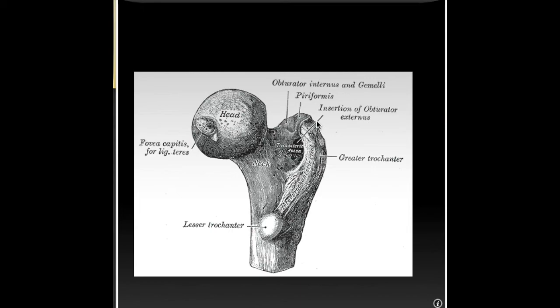So that's going to be one characteristic where we think the x-rays and the CTs tend to be a little bit better than MRI, because we can assess that matrix formation better. Sometimes for chondroid matrix, we describe it as a ring and arc appearance, and that's one of the important characteristics to have in mind. Although for osteosarcoma, we expect to have what we call osteoid matrix.